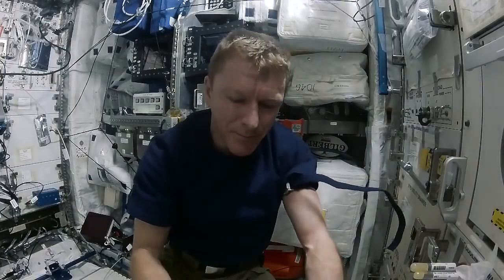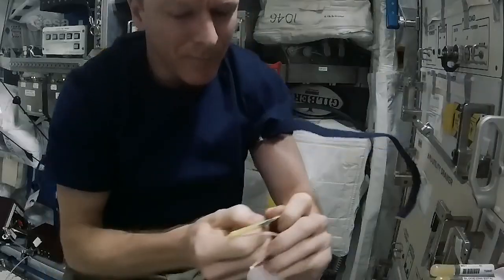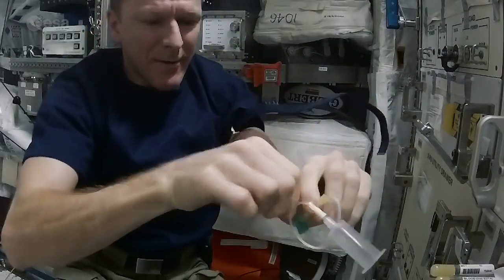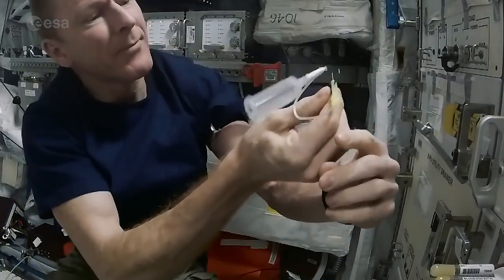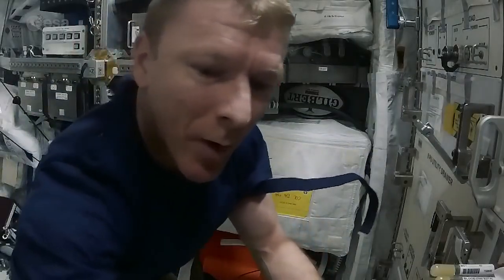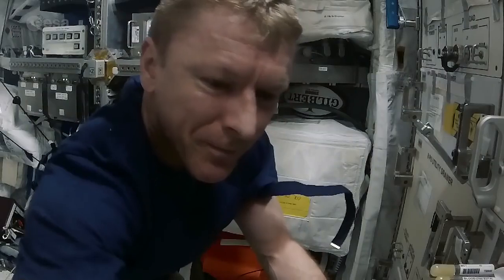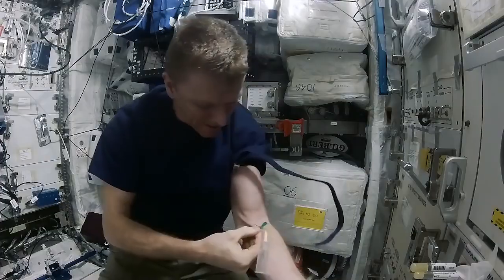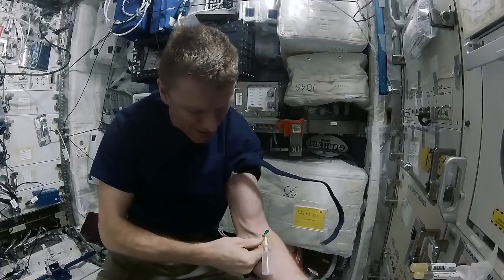Get my needle, check the bevel edge and get it the right way up. I've got a sharps container here as well, so I'll pop the debris in the sharps container. Then I'm ready for the stick — nice big vein, 30-degree angle.